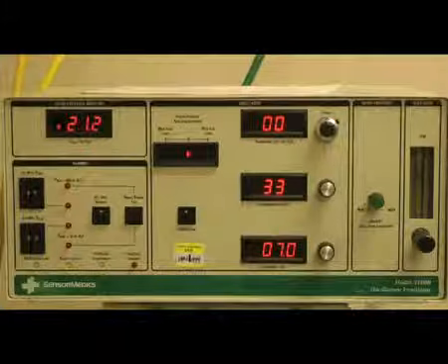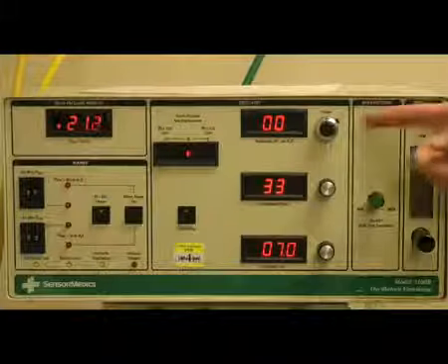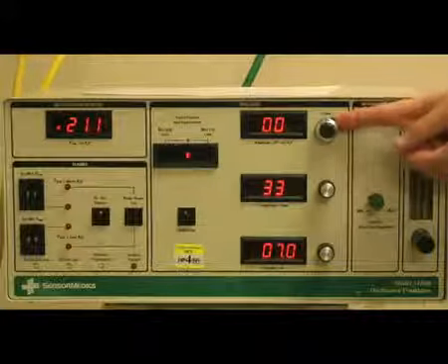Once you have set your FiO2, mean airway pressure, I time, and bias flow, you want to set an amplitude, or delta P, of 90. This is achieved by adjusting your power setting. Increasing your power will increase your delta P, and vice versa.